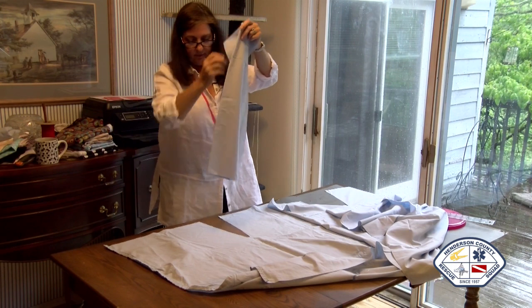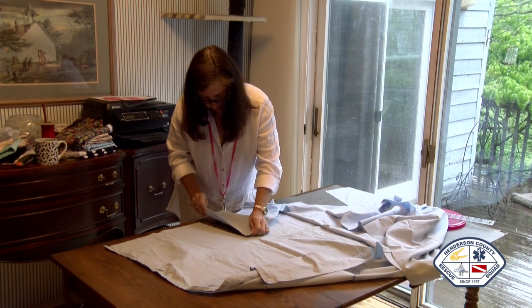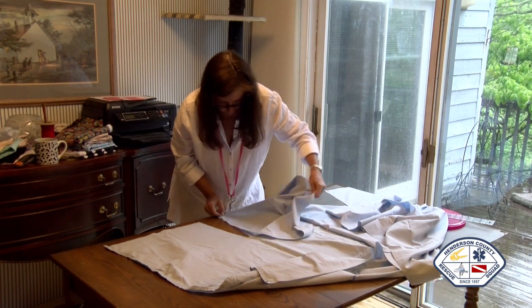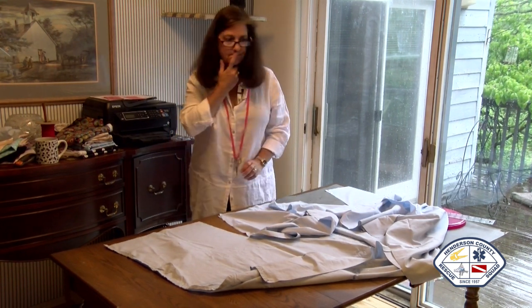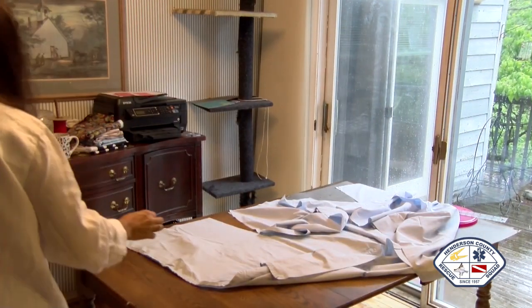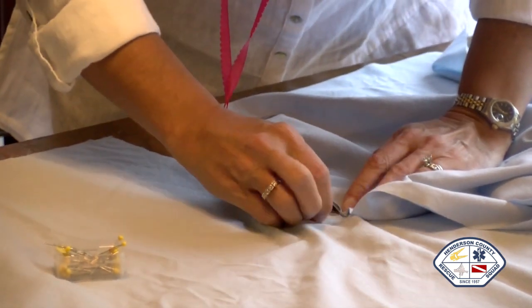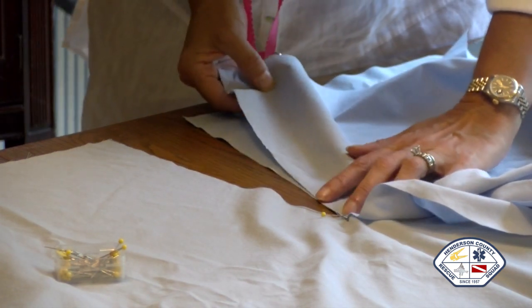The center seam here is going to the bottom center here. So, what we're going to do is corner to corner right here. Oh, there are my pins. Now, I'm not much of a pinner. I like to pin 4 maybe, but you're pinning so that your right sides of your fabric are together.